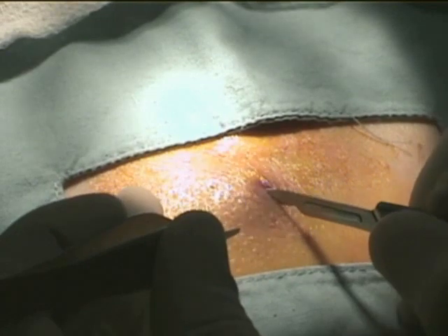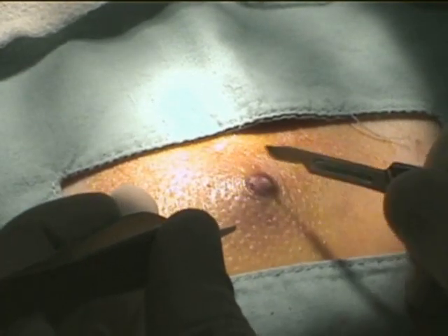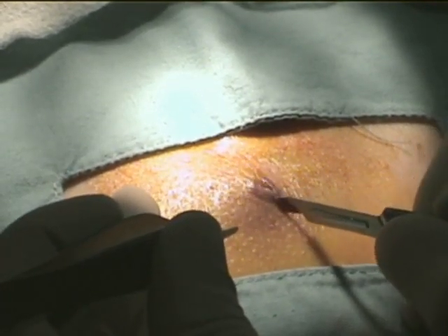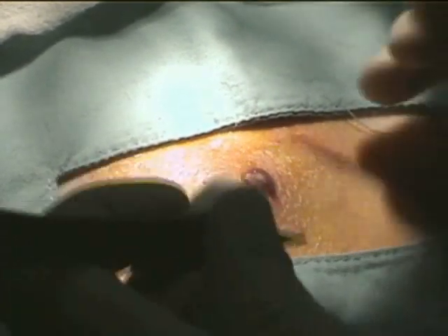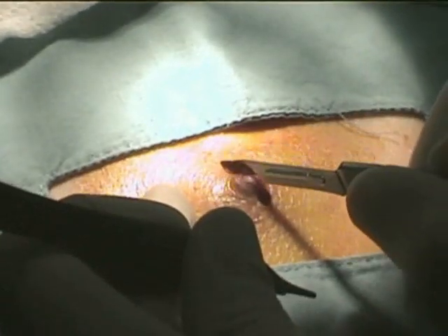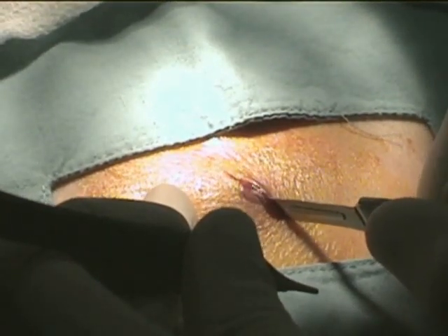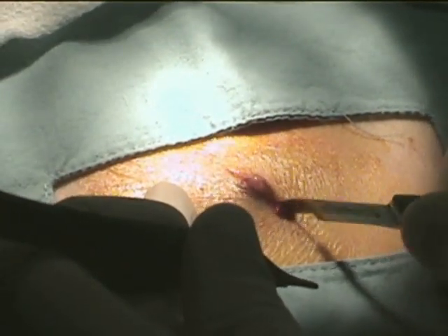Make an incision with a scalpel blade to allow drainage of the abscess cavity and to prevent premature closure of the incision. When possible, make the incision along the skin lines.